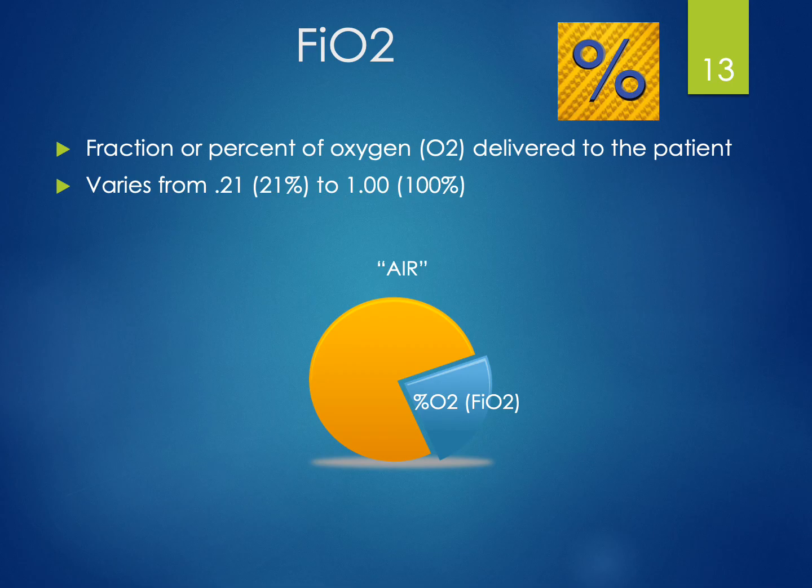So you can start to see a lower number means that our patient could be doing better. They don't need as much oxygen. They look more like you and I right now. And a higher number is a little more concerning.